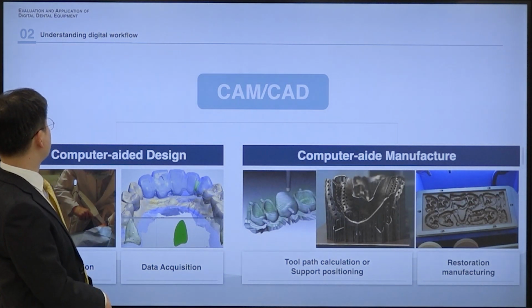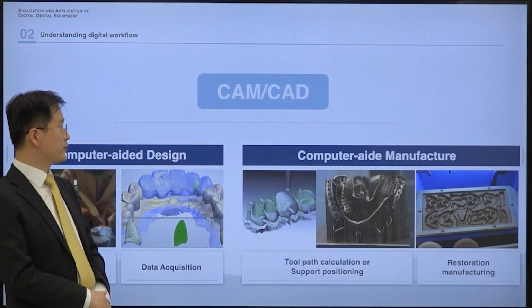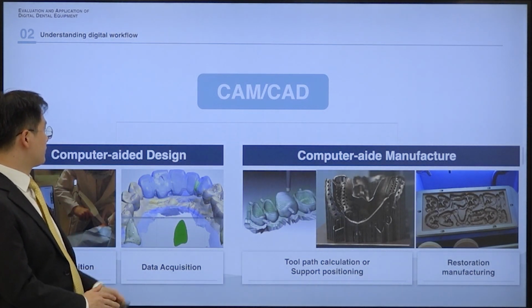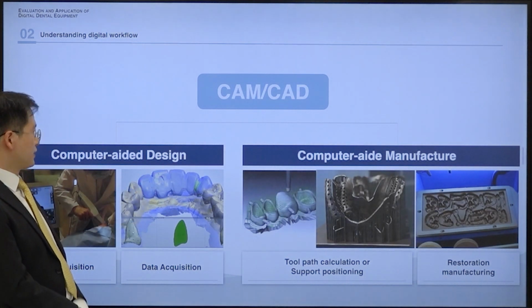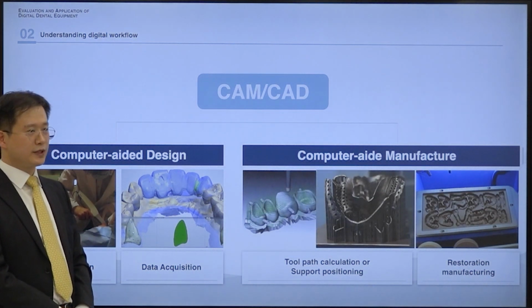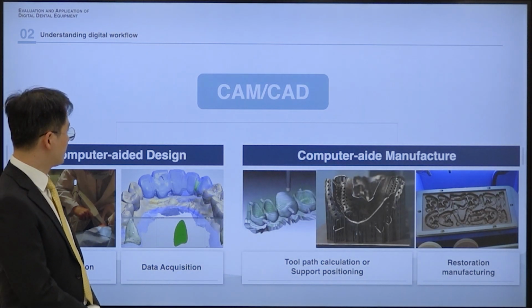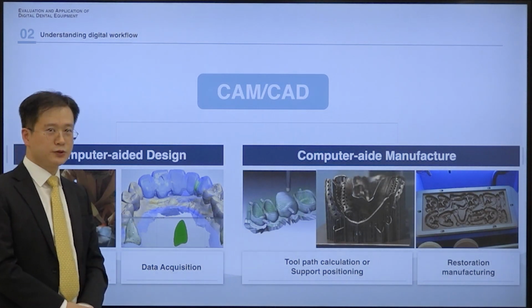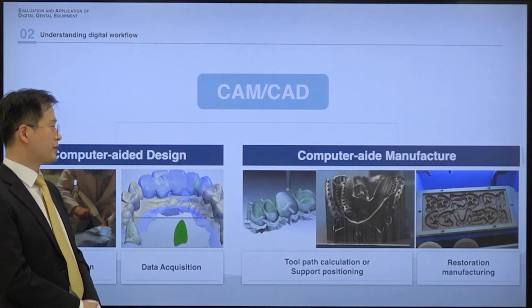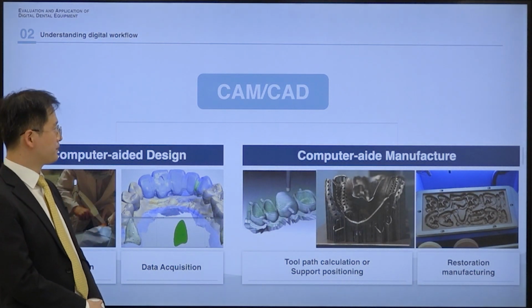The second lesson will be understanding digital workflow. The term CAD/CAM is divided into CAD and CAM. In dentistry, CAD also includes digital data acquisition, such as intraoral scan or model scan. And with dental CAD software, we can design restorations or appliances on the data that we acquired with various devices.